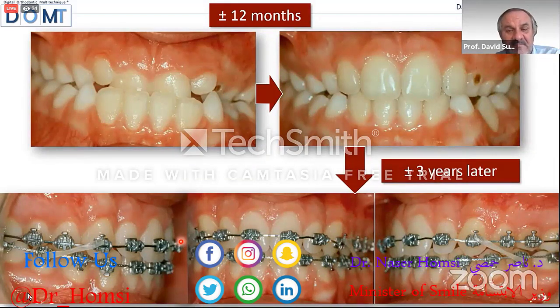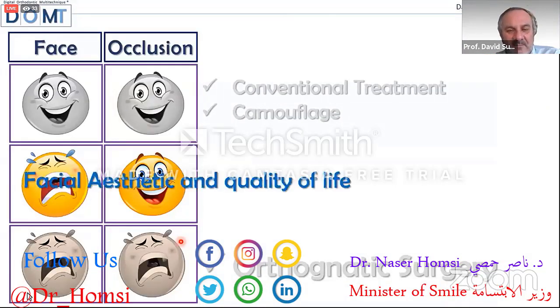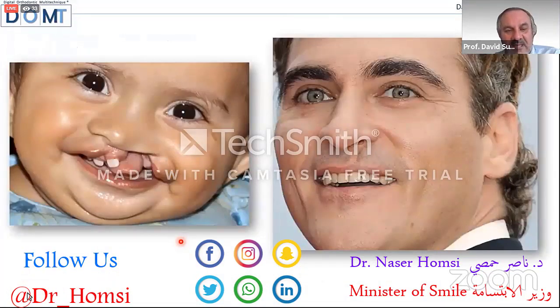with rapid maxillary expansion and facial mask. Now, 3 years later, it's time to put brackets in the upper and the lower, even finishing the patient with class 2 elastics. And at the end of the treatment, a very good, nice occlusion, and a very good relationship between the maxilla and the mandible.